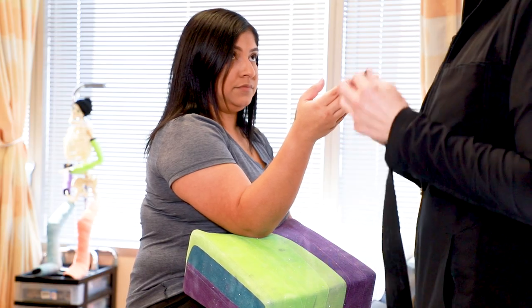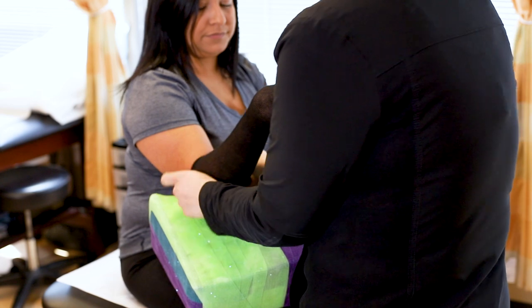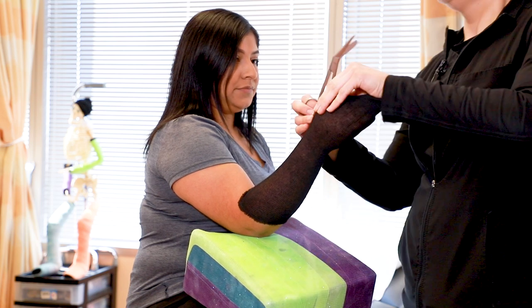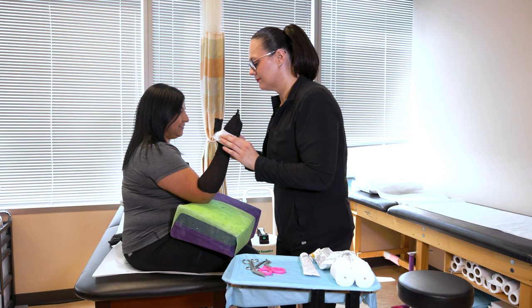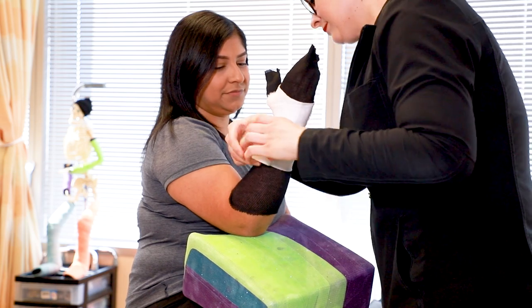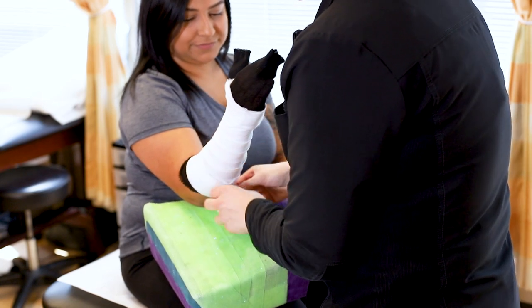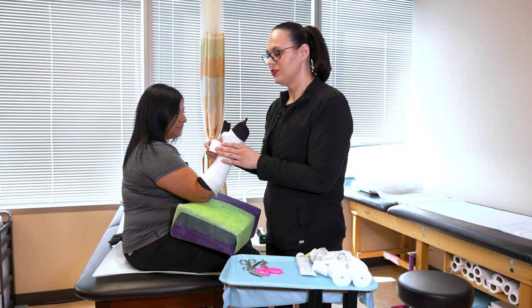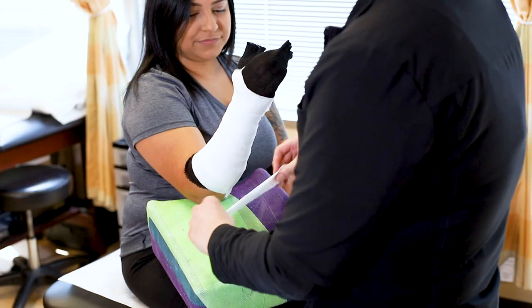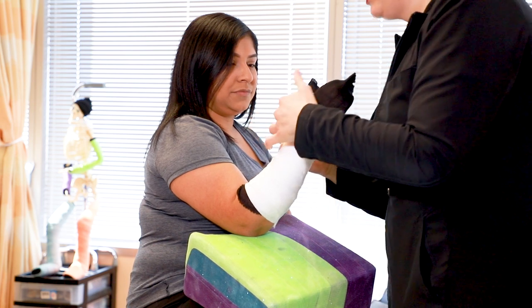First we'll start by applying the undercast padding, which is your stockinette and your web roll. That just acts as a barrier in between the skin and the fiberglass portion of the cast, which is the hard part. You will feel a little tension — not too tight — but a cast is made to fit snug to make sure that we are properly immobilizing your fracture, tear, rupture, or whatever injury you have.